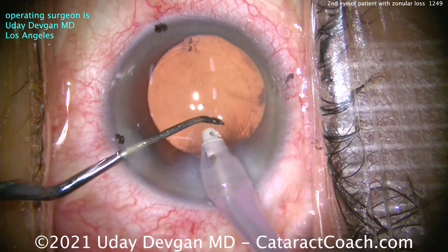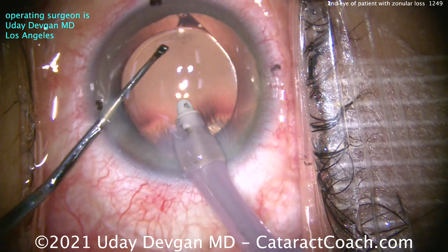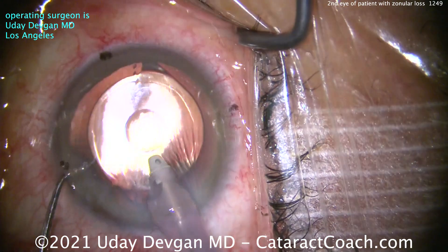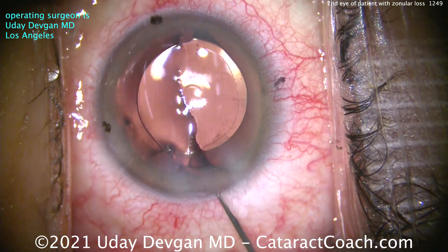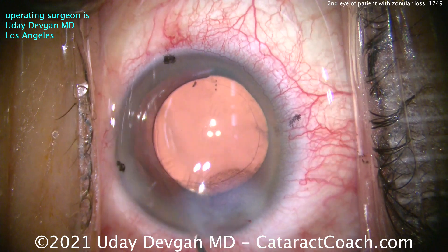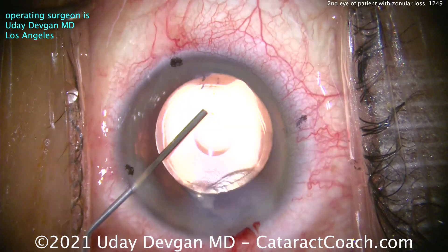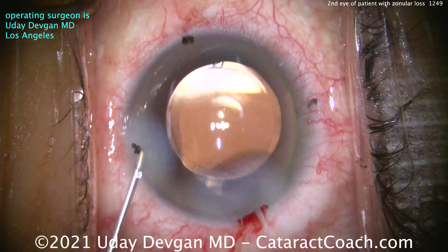If you're wondering how I mark these things and do toric IOL calculations, it's all on cataractcoach.com. Here's the end of the case — it goes beautifully. Sealing this up, his post-op course was uneventful, he did beautifully, and I'm really happy to say he's seeing well in both eyes. But keep in mind: if you have trouble on the first eye, you could very well have the same issue on the second. And if someone else did that other surgery, give them the benefit of the doubt.